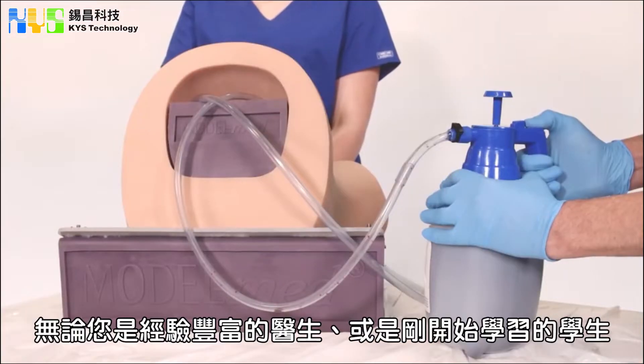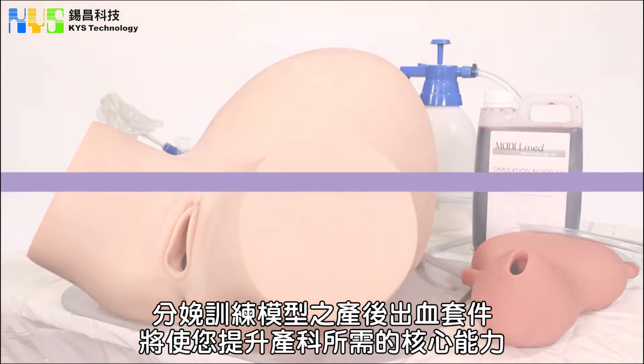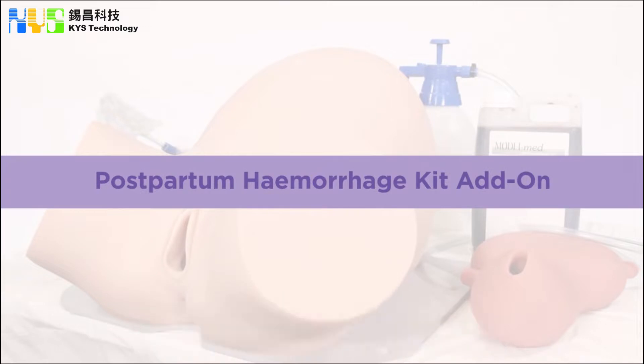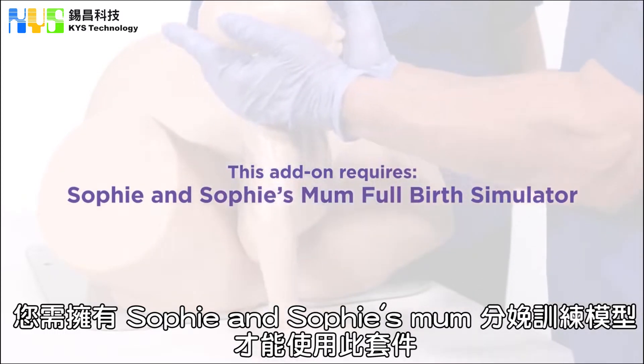Whether you are an experienced medical practitioner or a student just beginning their studies, the Model Med Sophie and Sophie's Mum Postpartum Hemorrhage Kit add-on will enable you to develop and enhance your core competencies required to manage childbirth. This add-on requires that you already own a Model Med Sophie and Sophie's Mum Birth Simulator.